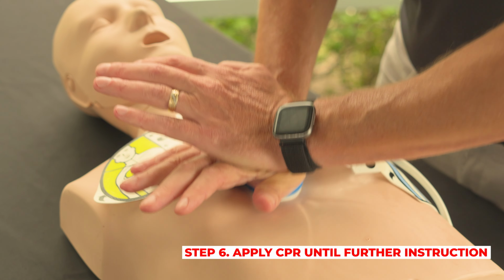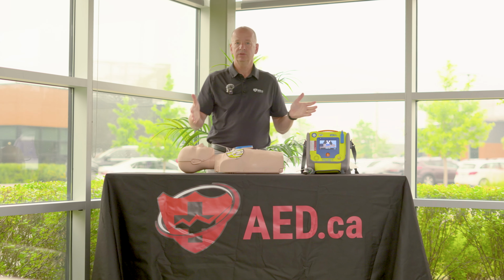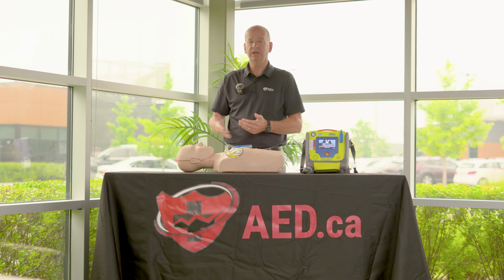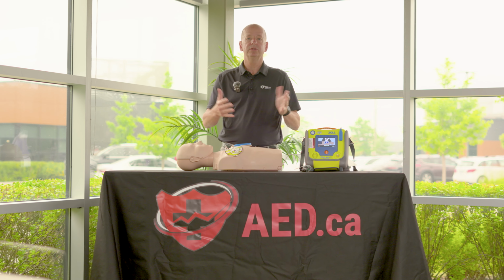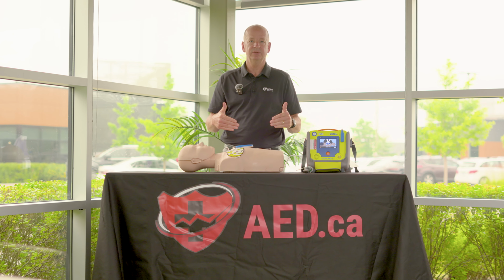Continue doing CPR until the AED prompts again for another shock analysis. You continue this cycle of the AED and CPR until the person regains consciousness or until the paramedics arrive and take over. It's important to note that you cannot hurt someone using an AED. It will only deliver a shock if it is needed.